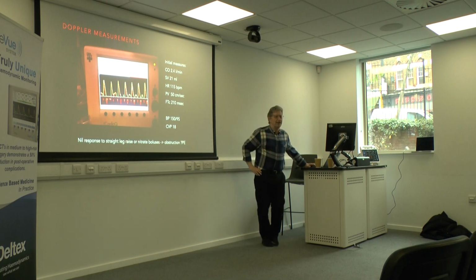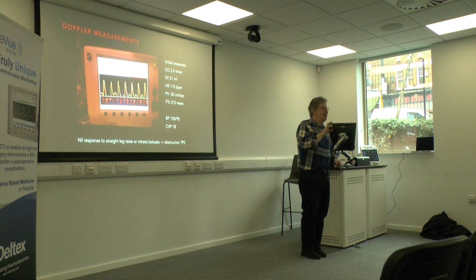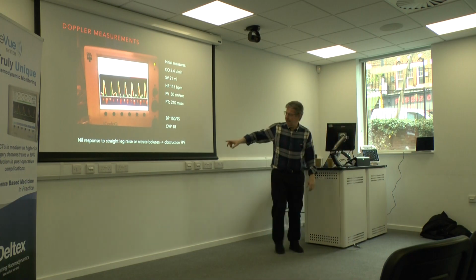And try the leg raise, straight leg raises as a fluid challenge. I like having nitrate boluses, because you get this short-lasting dilation. And if they're well filled, cardiac output goes up. But if it crashes, it suggests that the heart's empty for whatever reason.